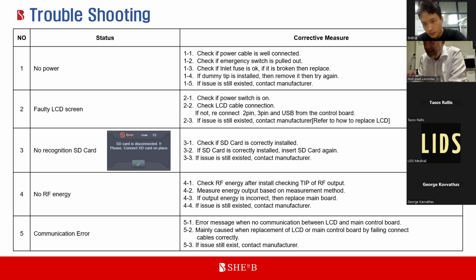So there is a device that we can check. Yes, we are interested to know about that. Thank you very much. There's an instruction for checking the RF output, and also a different device.